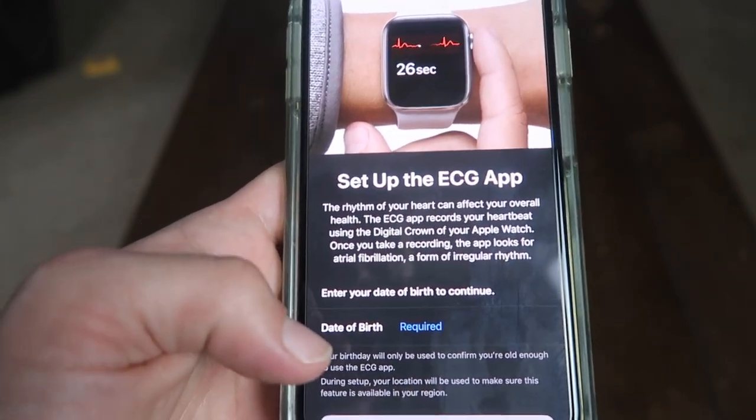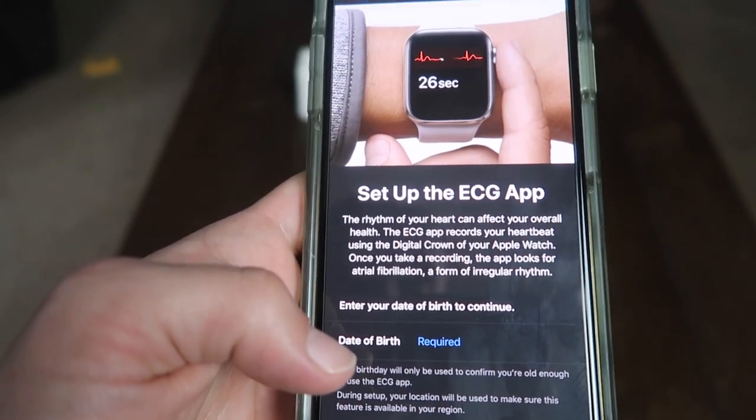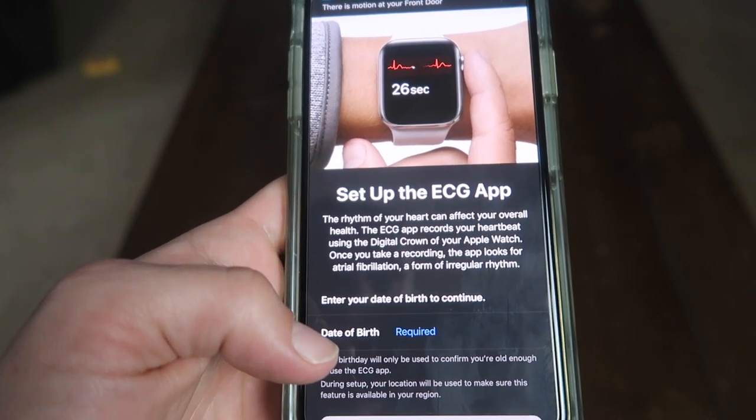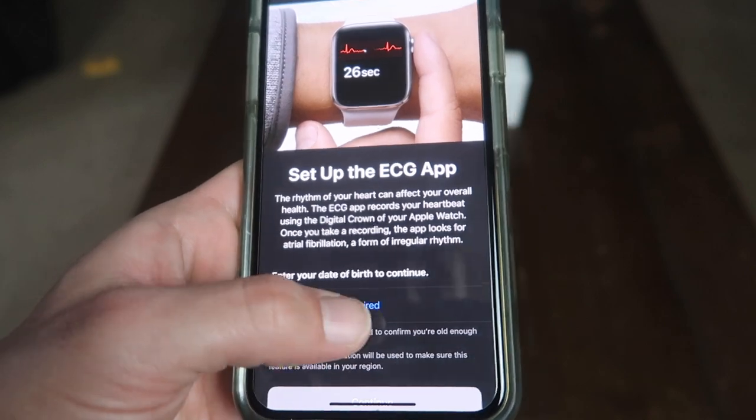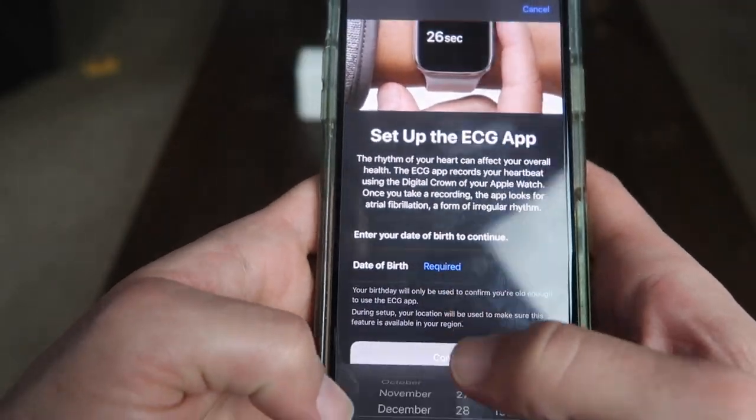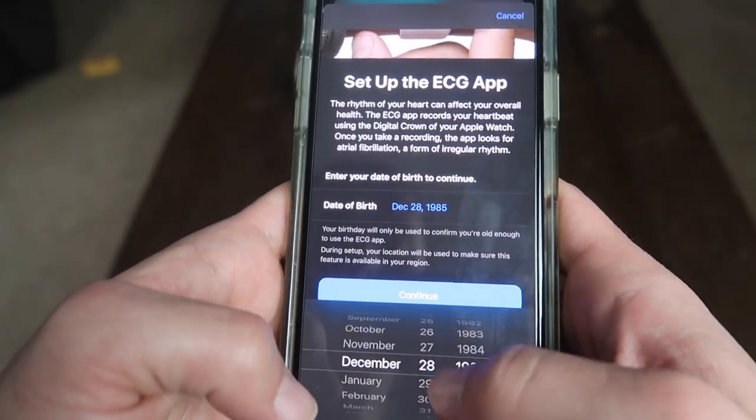It says the rhythm of your heart can affect your overall health. The ECG app records your heartbeat using the digital crown of your Apple Watch. Once you take a recording, the app looks for atrial fibrillation, a form of irregular rhythm. You need to enter your birth date to go forward, so I'll put my birth date in here.